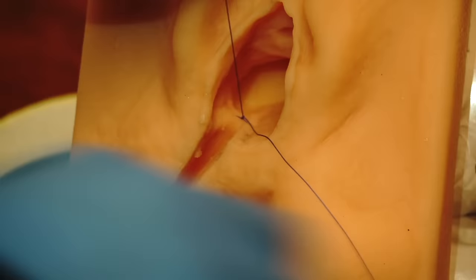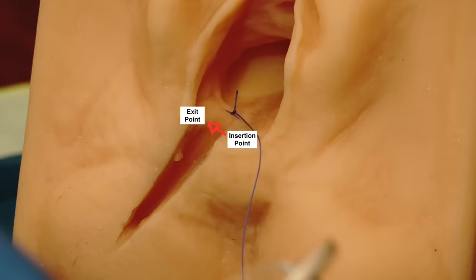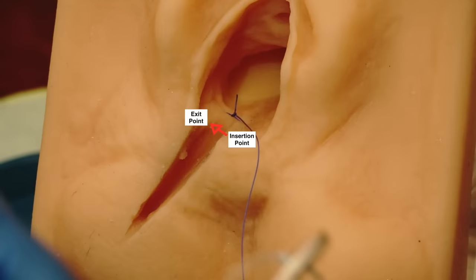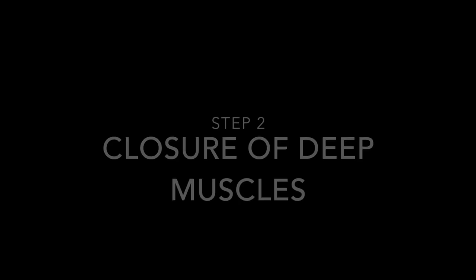So we're going to tie the apical stitch and I will cut the short suture. Now I'm ready to start the repair of the posterior vaginal wall with a continuous locked stitch. In order to place a continuous locked stitch, the entry point of the needle should be placed at the insertion point on the maternal left side of the laceration and then passed across sideways to the maternal right side where the exit point is. Then you will lock the stitch and run it all the way to the hymenal ring in this fashion.